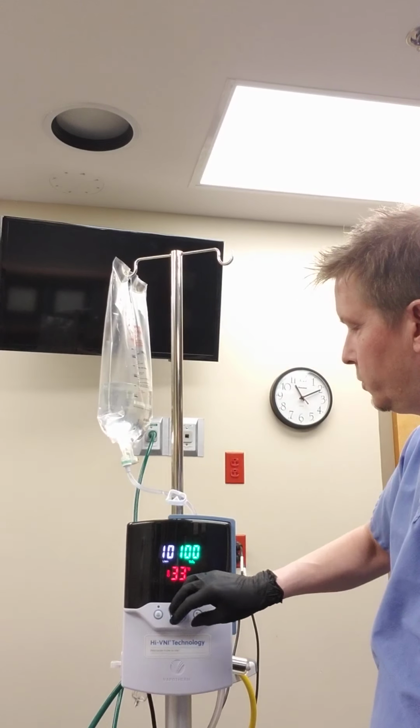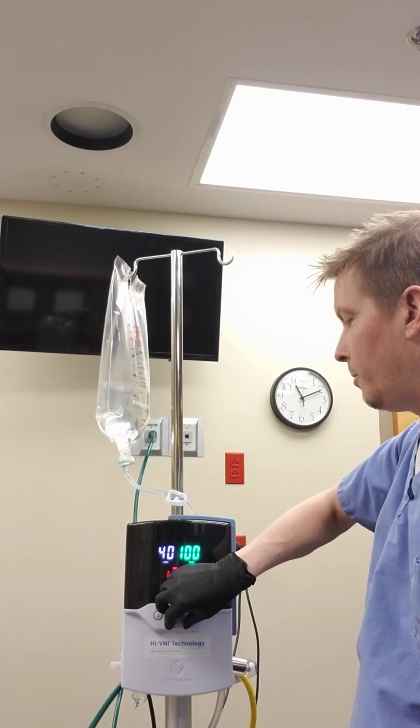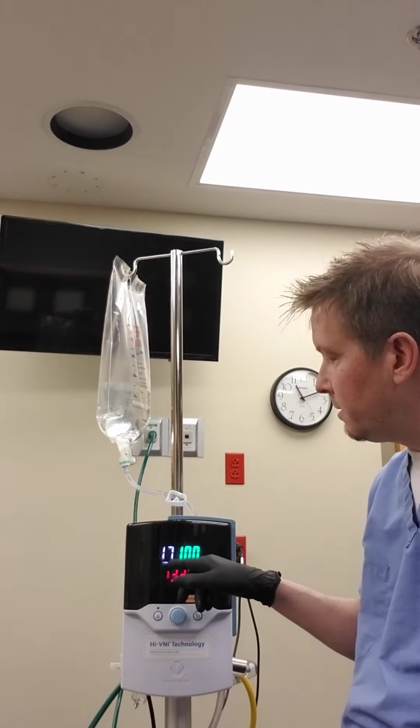So let's just go to flow rate. Flow rate on the Vapotherm maxes out at 40 liters a minute. What we generally do is monitor the patient, and we're trying to get as much flow rate in there as possible to wash out carbon dioxide, but not to be uncomfortable for the patient. That's how we know. We keep increasing it until the patient starts to become uncomfortable. That means we've met their flow demand. So we adjust flow rate based off of dyspnea or shortness of breath, and we manipulate FiO2 based off of their level of hypoxemia.